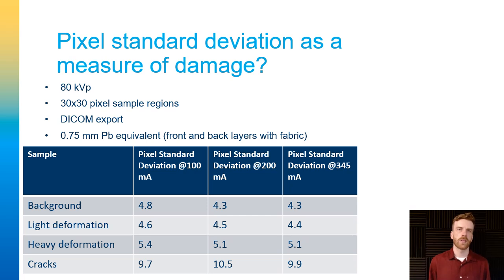So, could a standard deviation measurement be used to infer the presence of plastic deformation? I think it could, but it doesn't really affect the protection provided. The only benefit in my mind would be to see if this deformation exists in an already cracked or torn gown. I'd argue that it could add to the decision to remove a damaged gown from service that otherwise does not meet the criteria for retirement.